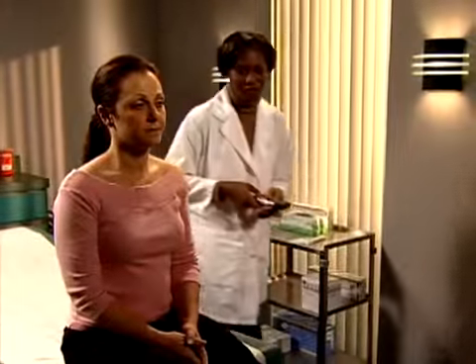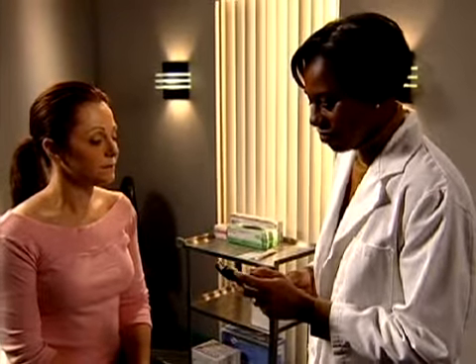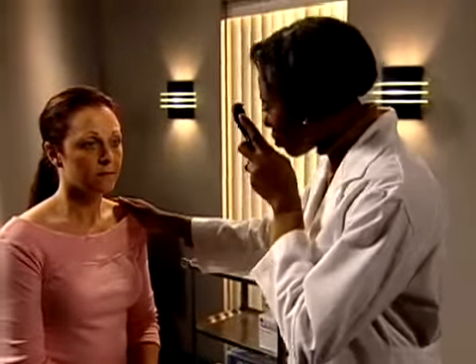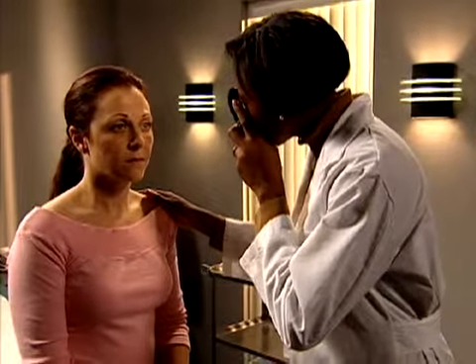Finally, perform an ophthalmoscopic examination, giving the patient short breaks to rest her eyes from the bright light. I'm going to examine the structures inside your eye. If you wear glasses or contact lenses, you may leave contact lenses in place. Is it okay if we start with the left eye? With the ophthalmoscope in your left hand and its lens set to 0, use your left eye to examine the patient's left eye, starting with the red reflex.